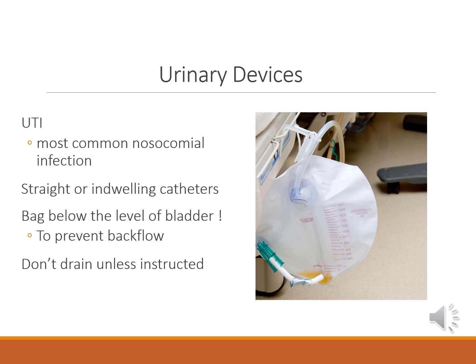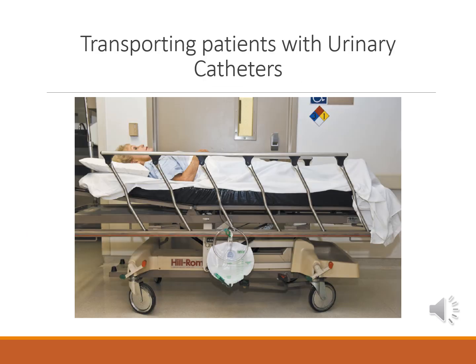Oftentimes, patients with catheters have their urine output measured, so you do not want to disrupt the measurements by emptying the bag without being told to do so. When transporting a patient with an indwelling urinary catheter to the diagnostic imaging department, the drainage bag should be kept below the level of the bladder to ensure proper gravity and flow and prevent backflow, which could cause a urinary tract infection.